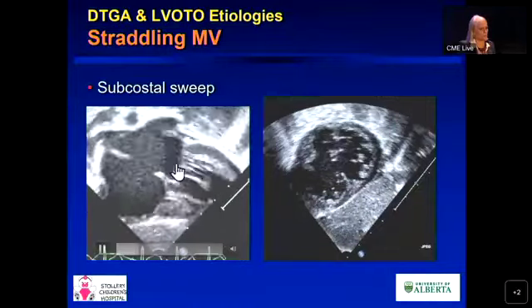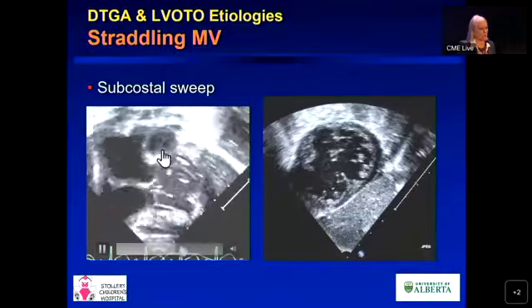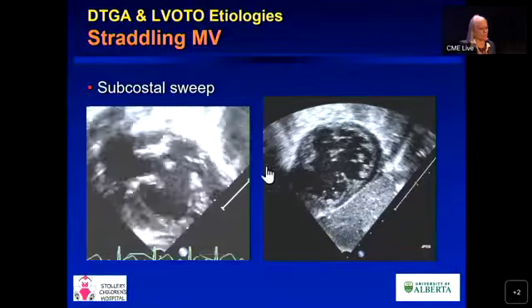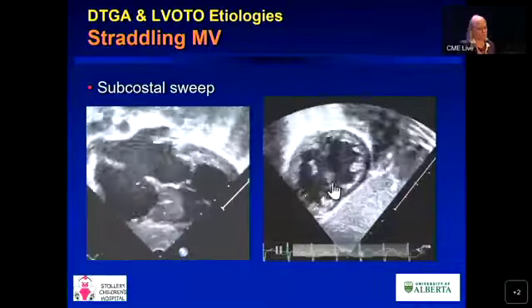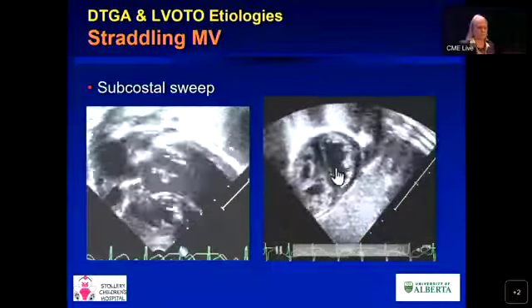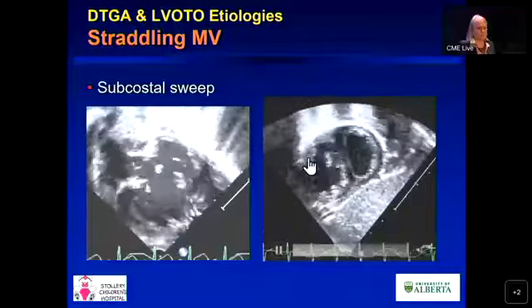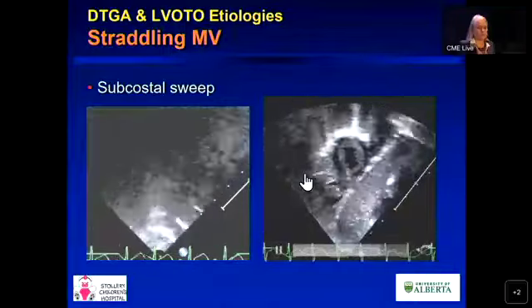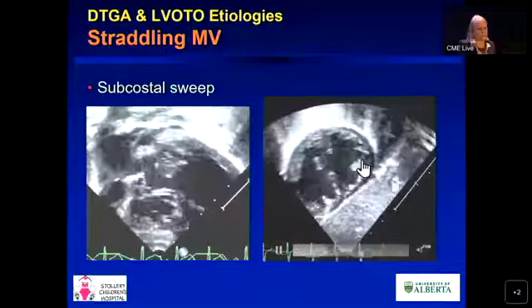So this is a mitral valve that you can clearly see as you sweep up attachments on the right ventricular outflow side here. All right. So here we go. I love the off-axis view. This is a little bit more like a double outlet, only in that where the ventricular septum reconstitutes is different from where you've got a little bit of anterior malalignment of the conal septum. There wasn't a lot of aortic outflow obstruction, but the bigger concern was just what this mitral valve was doing.